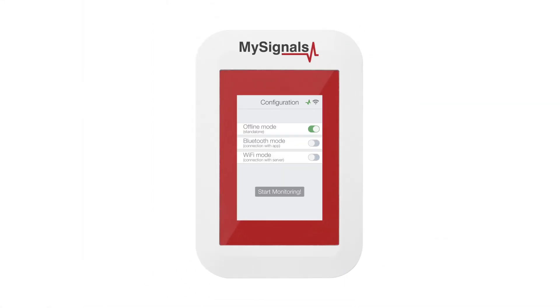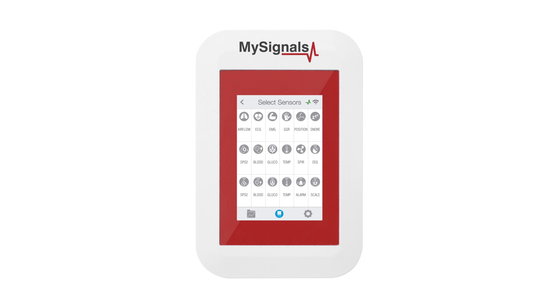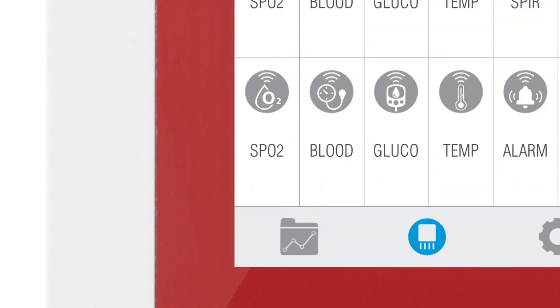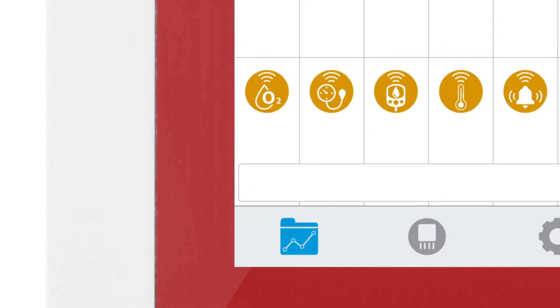In the sensor selection screen, you can see all the sensors available. By selecting the Airflow sensor, the icon will turn blue. Then click on the data button to access the data screen and start visualizing the data.